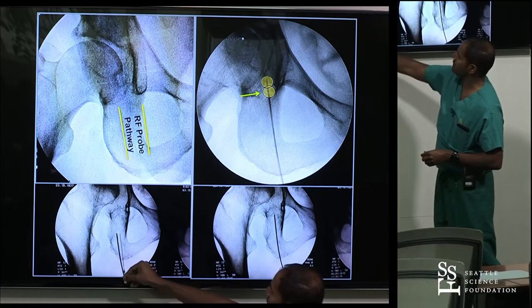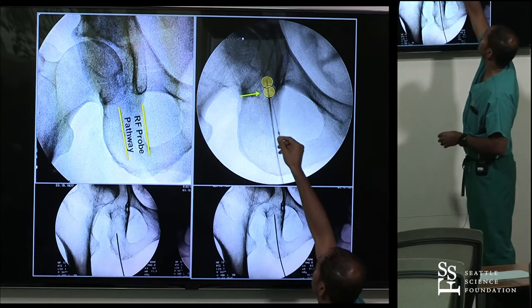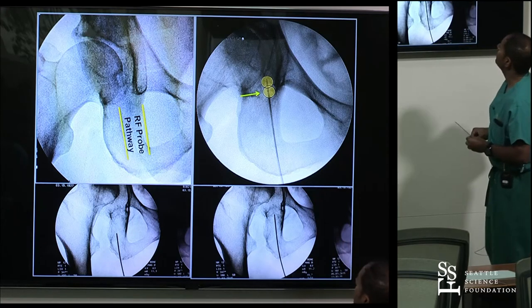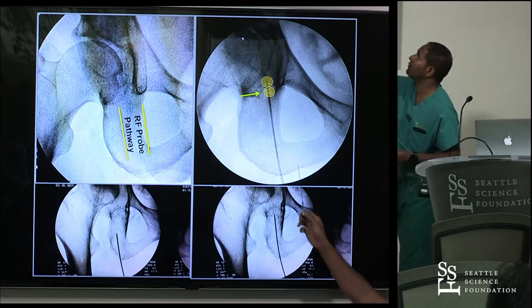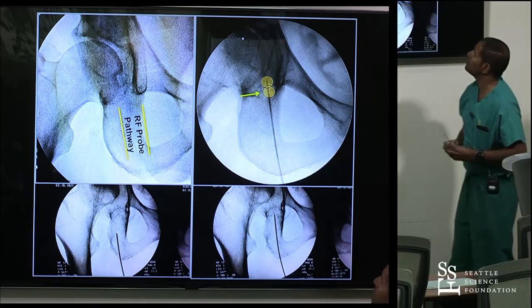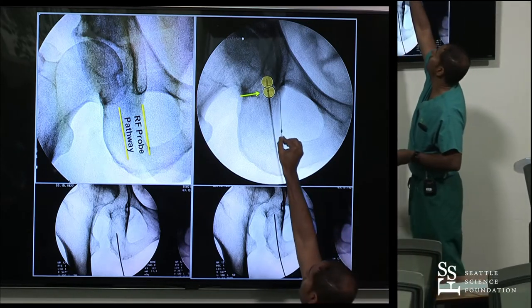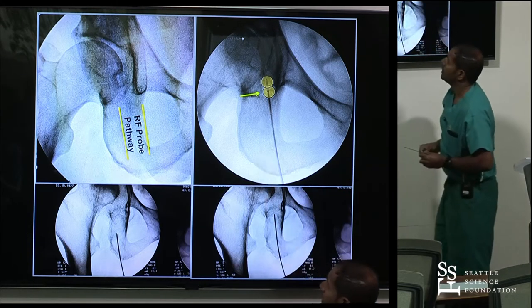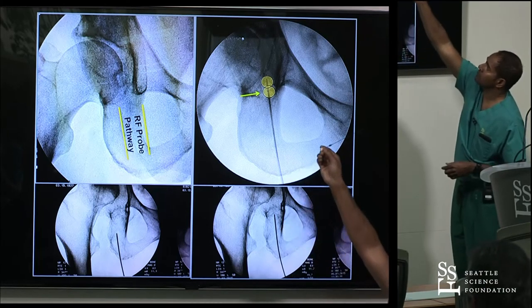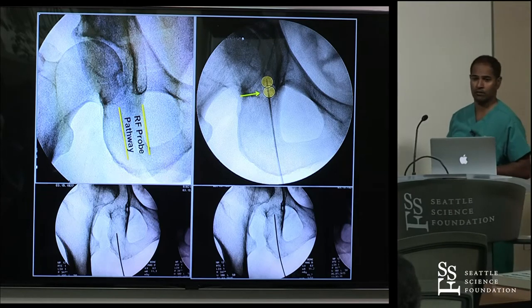Continue advancing the 17-gauge needle. Once it hits os, continue advancing to the two lesion locations — above the incisura and below. Super important to do motor testing here. I have had obturator motor stimulation — if that happens, it probably means you're too medial and you need to come back toward the acetabulum. Generally at the 12 o'clock position for the superior femoral articular branch, I have yet to see motor stimulation.